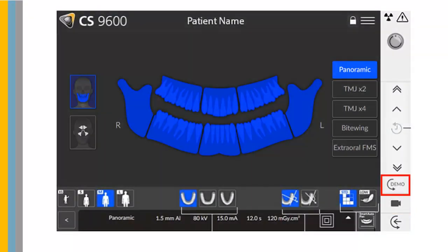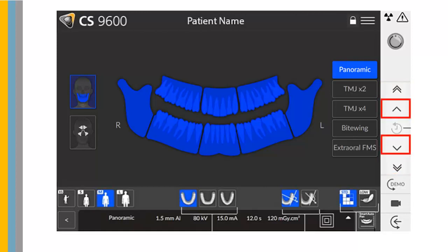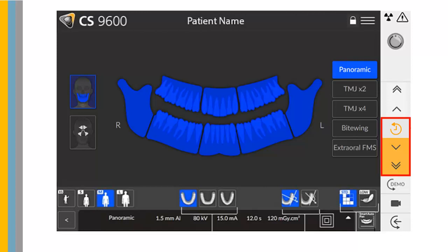The Demo function enables you to demonstrate acquisition procedures to a patient without x-ray. Fast and Slow Height Adjustment Buttons allow unit height changes. Patient Data History — parameters and unit height are automatically recorded when a patient has previously been examined; the unit will detect this and the icon will turn orange. Select it to use the recorded parameters. When the height adjustment buttons are highlighted, the user can move the unit to the correct height before the patient enters.